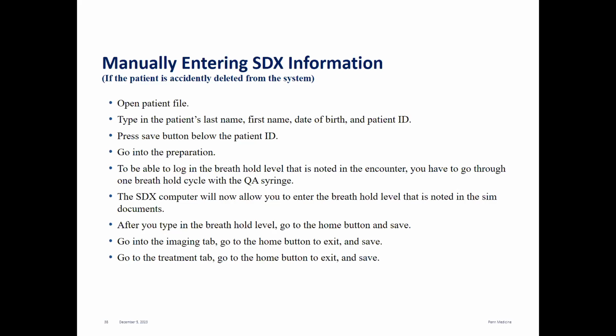You don't have to actually do anything in it. And then you go home, of course, and then exit and save. This will automatically put you into the treatment tab. So now you can just get started with the patient's treatment, filming process, and the whole 9 yards. Then you can exit and save it.